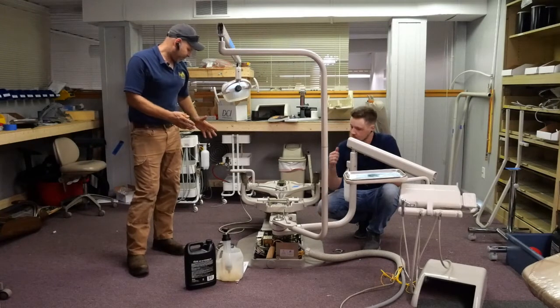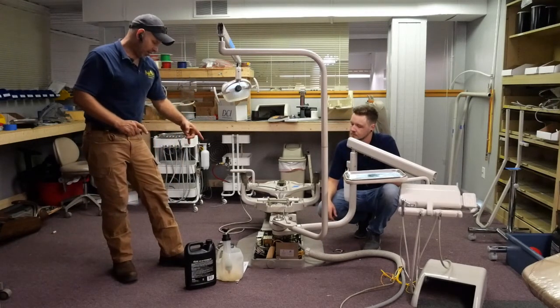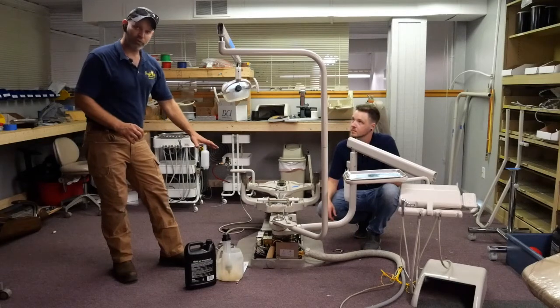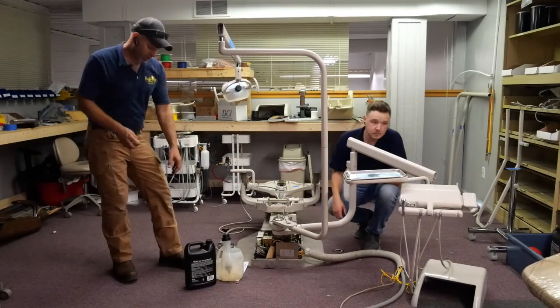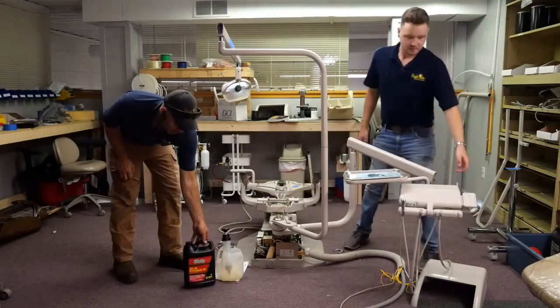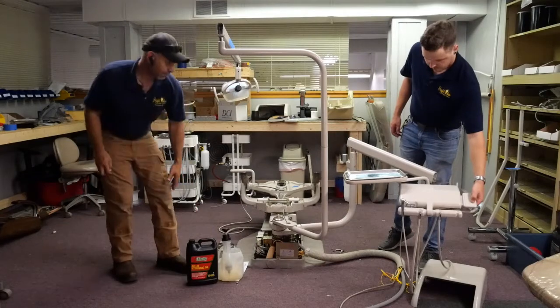Those are the things that we have for you here today. Pretty much that's how to adjust the speed on the control valve for your dental chair. It is how to access the reservoir for your dental chair, hydraulic fluid, and also what kind of hydraulic fluid that you can use in order to fill up your dental chair.